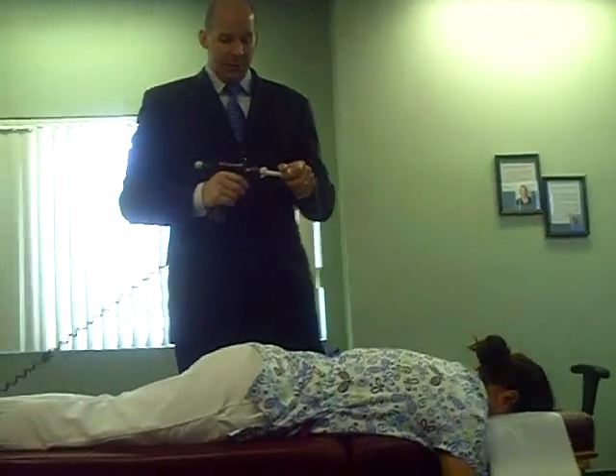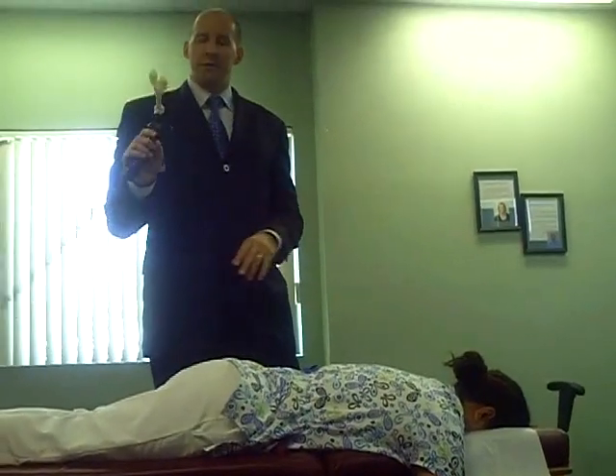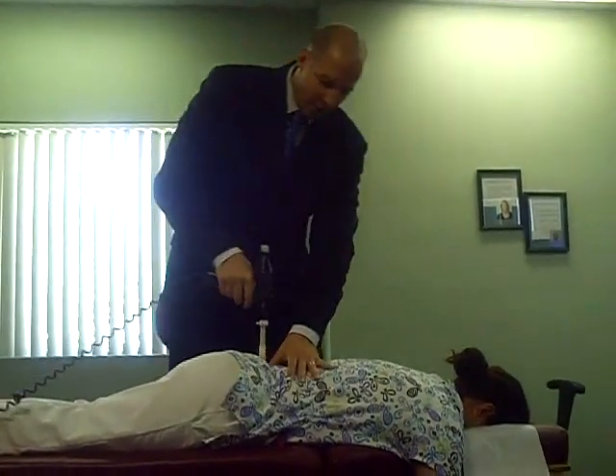Welcome back again. With the adjustments that we do, the chiropractic adjustments we do, sometimes I use this, what's called an arthrostim. This is a really light, handheld instrument that uses really light tapping force into the spine.